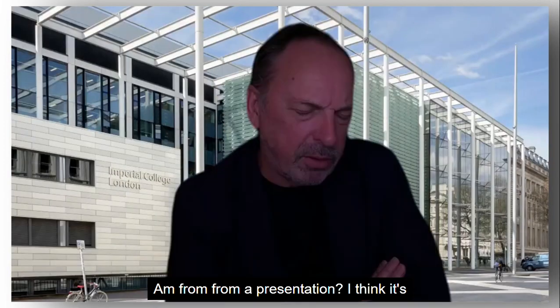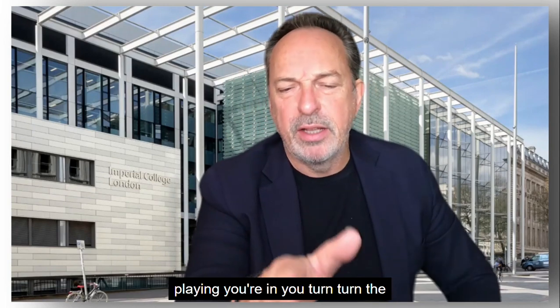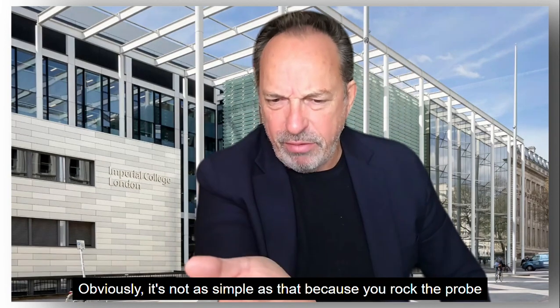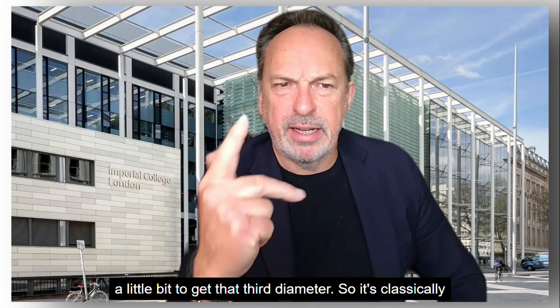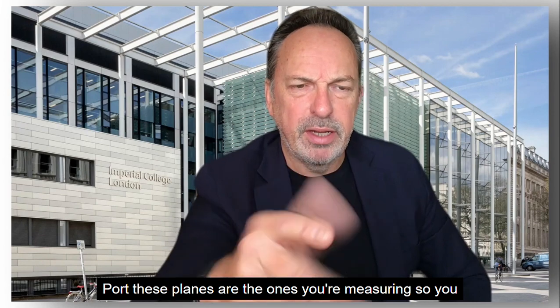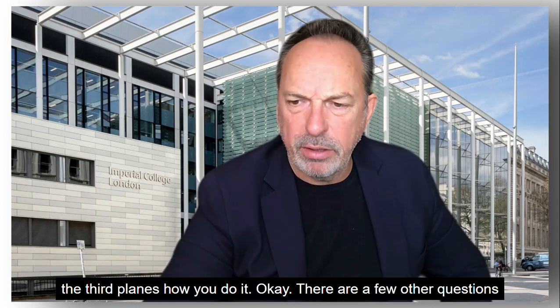I think it was going back to Lille, wasn't it? Essentially, whatever plane you're in, you turn the probe at 90 degrees. Obviously, it's not as simple as that because you rock the probe a little bit to get that third diameter. So classically, this is what you're measuring. You have these 3 planes, and you have to rotate from there to that way to get that other plane. So it's the third plane is how you do it.